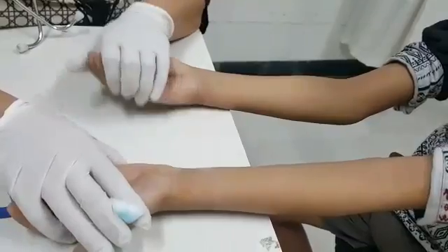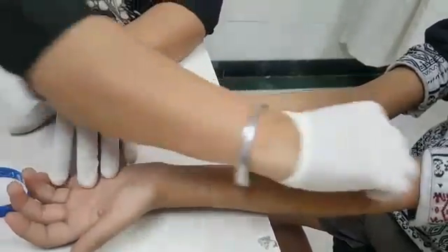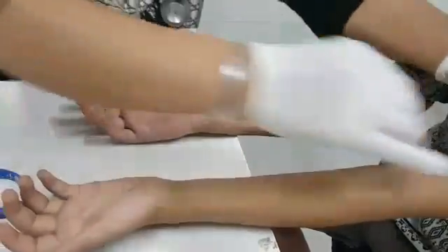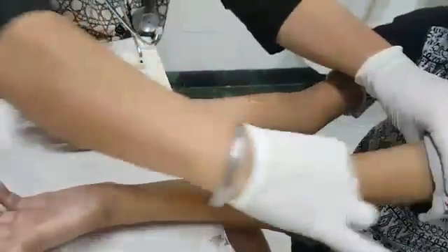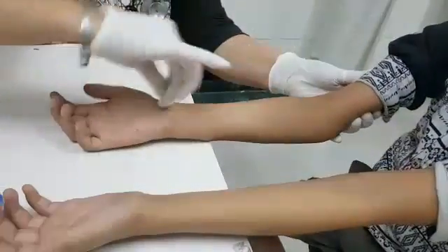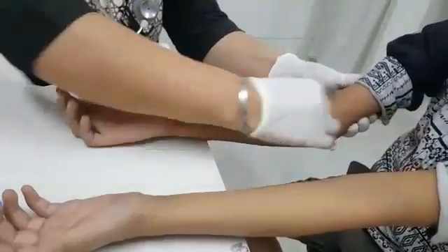The procedure starts like this: first, we have to clean the child's forearm properly with a spirit swab, the way we are cleaning it right now. We have already cleaned it but we are doing it again to show you.